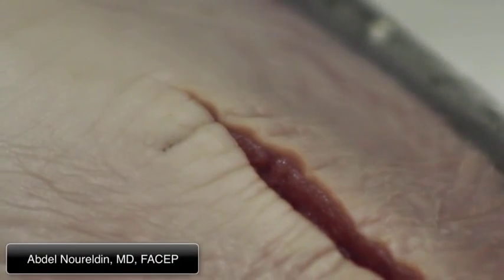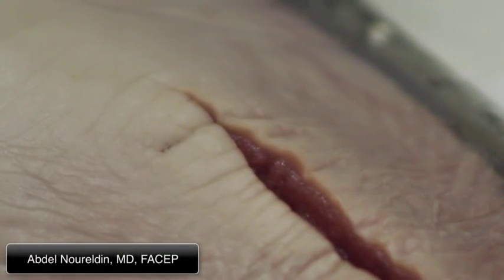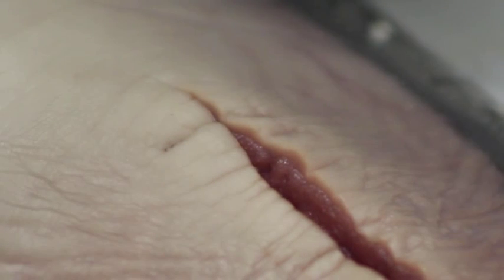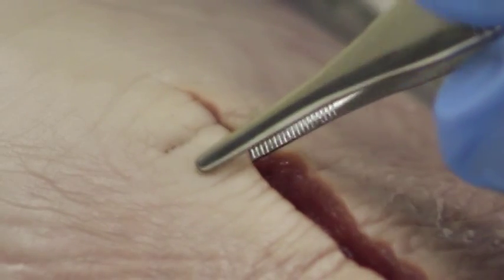Okay, we're going to show you how to do the vertical mattress. Again, your needle holder and your forceps should be used as a fork and knife. So we grab the edge.